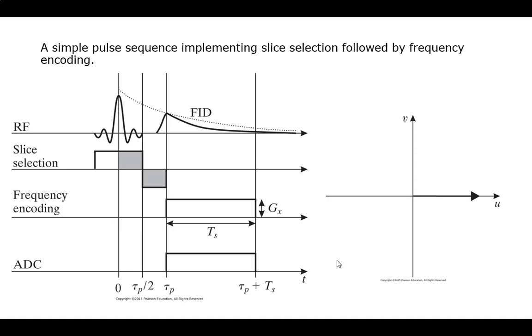Yeah, this is your sinc. So sinc to rect. It's truncated and corrected for the truncation, so it's not going to be perfect for rect. You're going to get the overshoots and whatever. But it will be reasonable, at least somewhat close to it. So we're trying to give a nice uniform push.